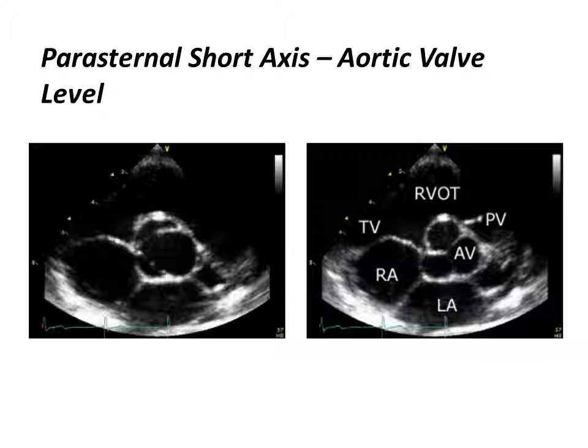All these views have been demonstrated in a separate clip, which is pretty poorly done, unfortunately, but you can have a look at it, and there is a running commentary of the live view of the parasternal long and short axis.